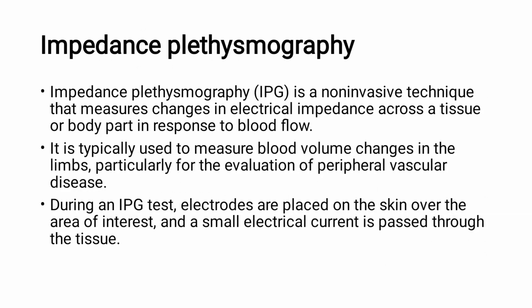The next thing is impedance plethysmography. This is also a non-invasive technique. This will measure the changes in the electrical impedance across the tissue or a body part in response to the blood flow. This is also used for measuring the blood volume changes in the body.